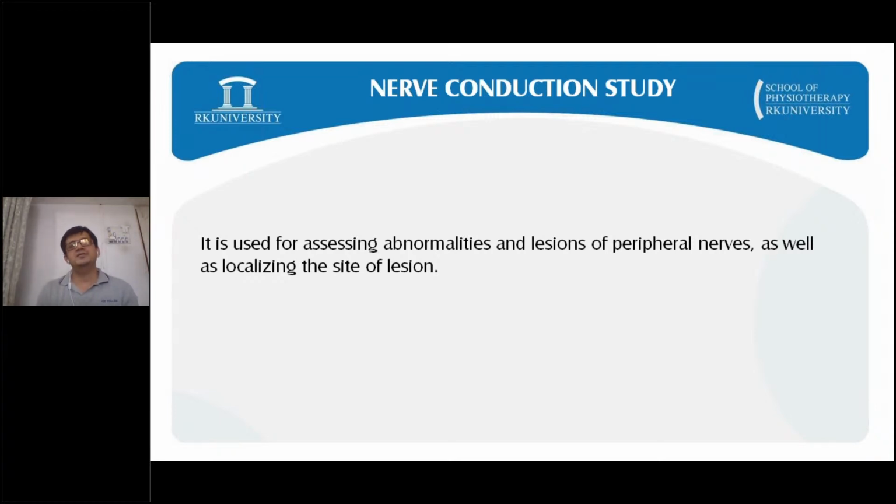Okay, that this is PRD, this is CRD, this is normal. But in case of NCV, you can identify how many percentage of axons are affected. Clear? As well as this will give you quantitative data, like now conduction velocity 52.24 meter per second. So it is giving in numbers, in digits. Clear? So it is giving you quantitative data. The SD curve was not able to localize the site of lesion. By this NCV, you will be able to localize the site of lesion also.